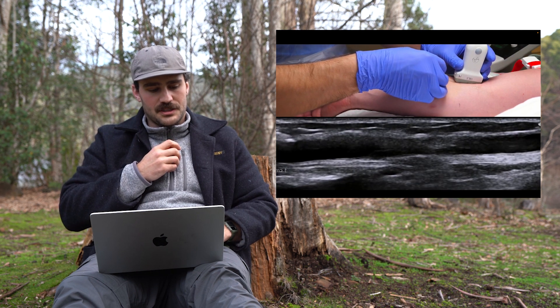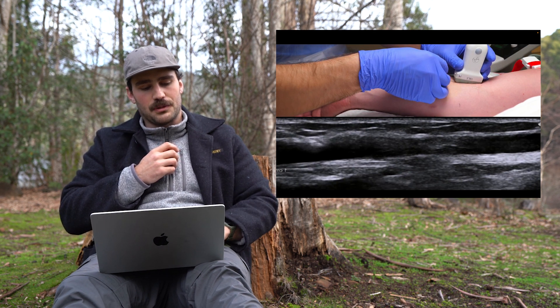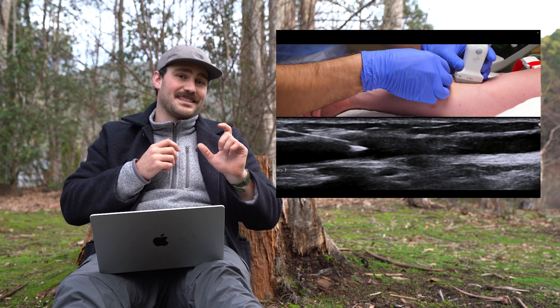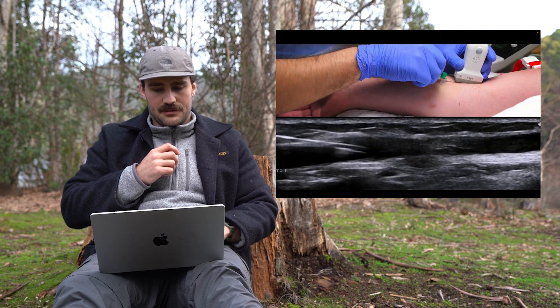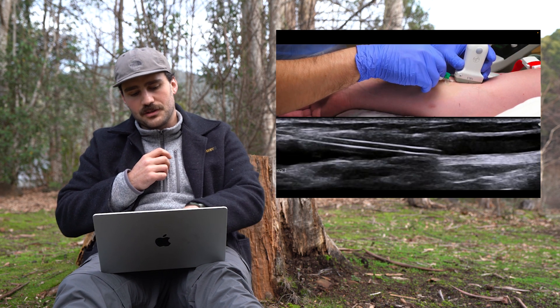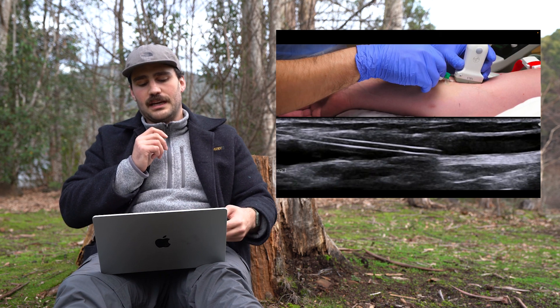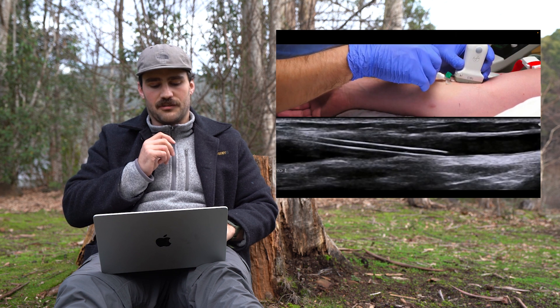They put the needle in — you can see it coming in. The tip of the needle is that white tip coming in from the left side of the screen, just below the arm. There's the tip, and now we're inside the vein. What you should see in that chamber is the flashback — that red bit of blood coming back. You can see it coming up the tubing. Now the white tip of the needle is being withdrawn and the plastic tubing — those two white lines — is being left in. They've swapped places: the needle for the tubing.